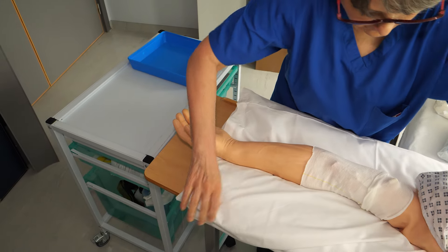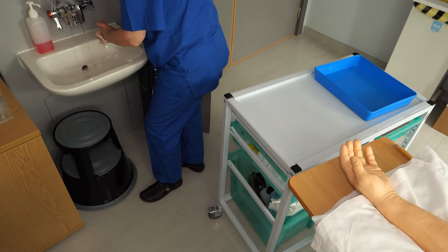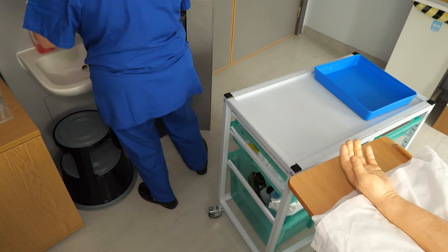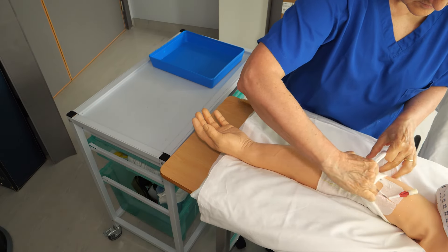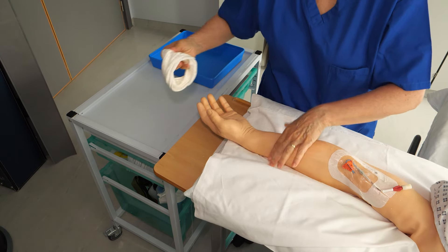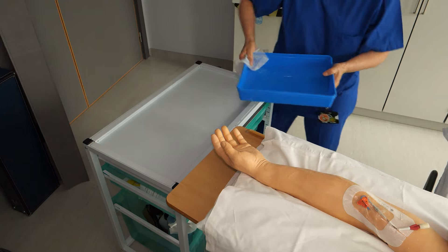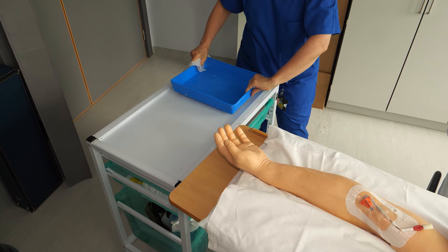To start with, make sure you are both comfortable with enough space and a surface to work from. Wash your hands. Remove the outer fabric cover. Wipe the working surface with an antibacterial wipe, spray or soap and water. This area is ideally a tray that is just used for PICC care only. Ensure that it is allowed to air dry.